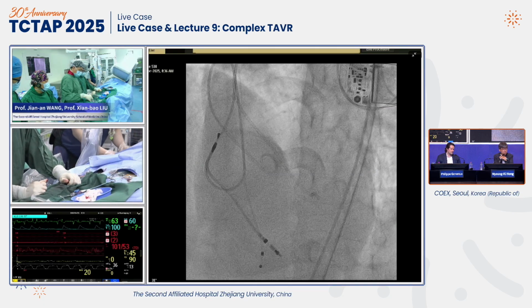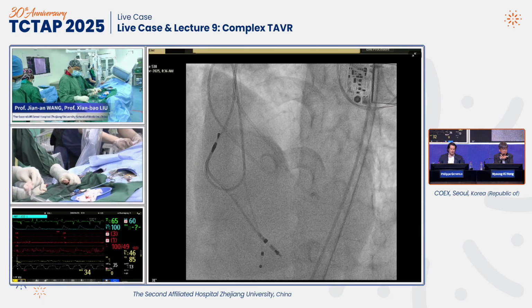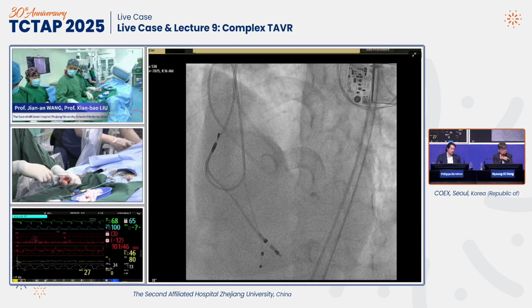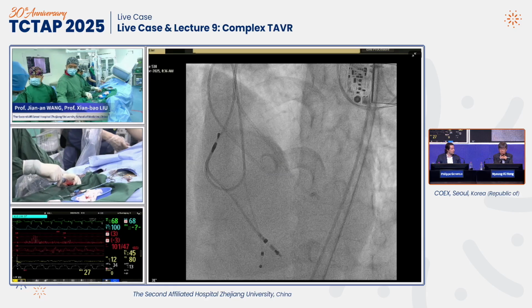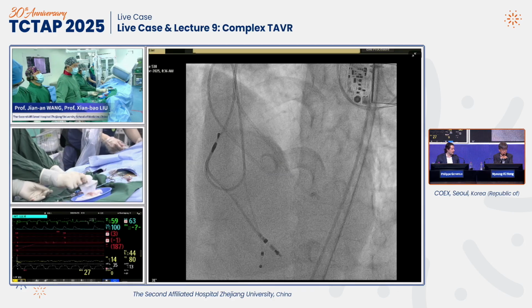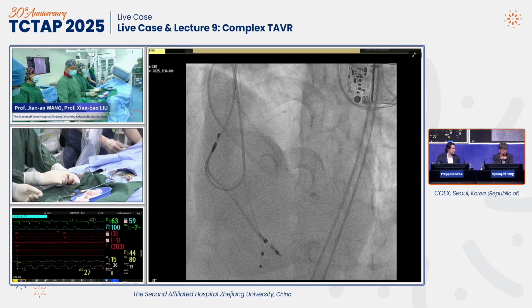That said, if this bicuspid, like was mentioned, the raphe is not too calcified as far as we can see on the CT scan, and the coronaries are very high, I think that's all good sign for the patient. We could go S3 23, which would be a little undersized, but I like the strategy of balloon and also self-expandable. Pro 26 most likely versus 29.